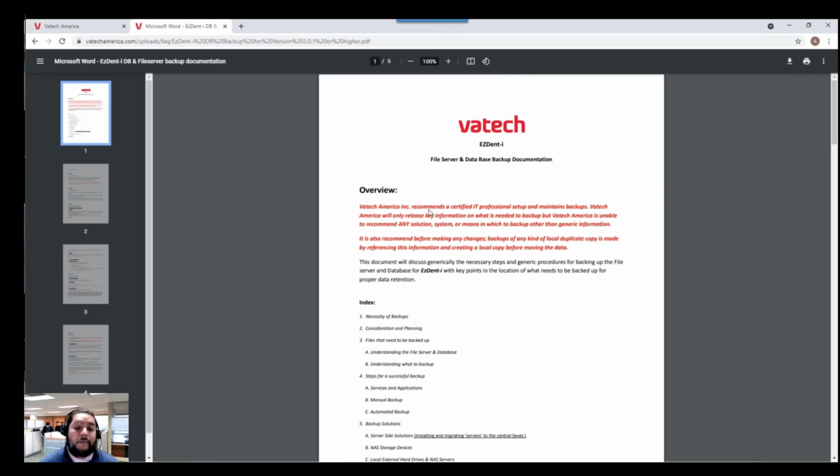It's a bit lengthy, but it's necessary to review in order for you guys to have a plan for disaster recovery. And Roger, really, this is the first step even before we update our software: we have to back up to get all the patient data backed up before we do our updates to our Dent-Eye or Easy Server or any of this. So this is really, I would say, probably step one. Absolutely. Like I mentioned earlier, before the installation, we got to prepare. So preparing for the backup, preparing for a software upgrade is ideal. I'd rather spend more time preparing for a task so that it can be done properly as opposed to just winging it, for example.